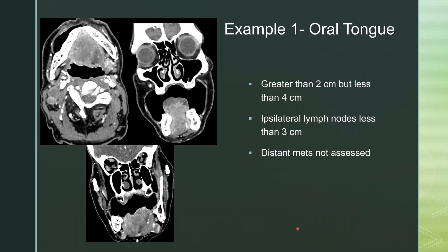Example one: if you change the windows, there is a hyperdense mass involving the oral tongue. Here's normal muscle, which is a little bit lower density than the mass. It measures greater than two centimeters but less than four centimeters. There are ipsilateral lymph nodes — one is even partially necrotic in the center — but they measure less than three centimeters. Distant mets are not assessed. You can see the difference in density between the tongue itself and the cancer, and here's another necrotic node. So this one would be a T2N2MX.